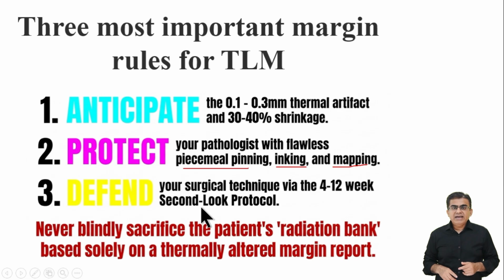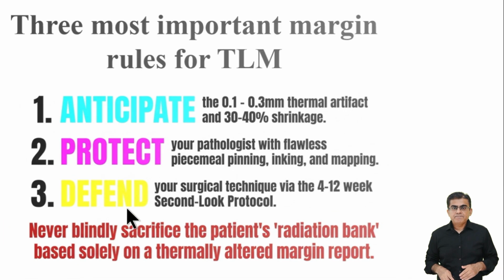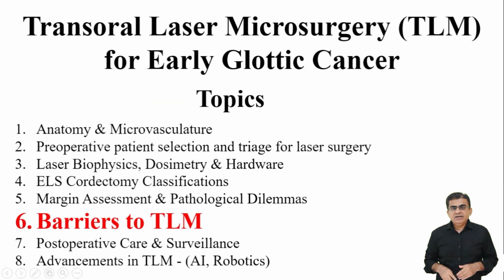Finally, you must never blindly sacrifice a patient's radiation bank solely on a thermally altered margin report. Following these three strict rules will make you a truly safe and effective laser surgeon. With this slide, we conclude our discussion on margin assessment and pathological dilemmas in TLM surgery. Let us move on to the next topic of our presentation.